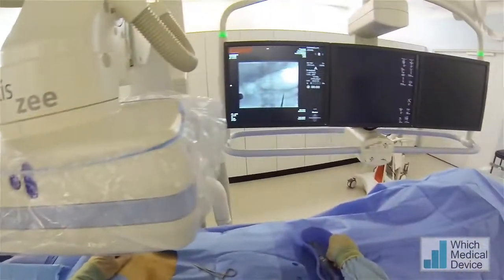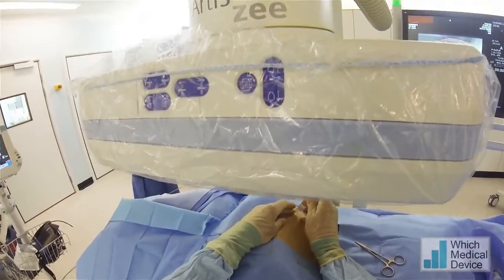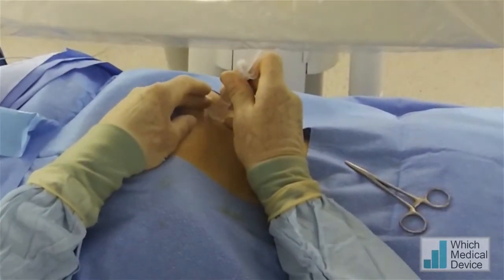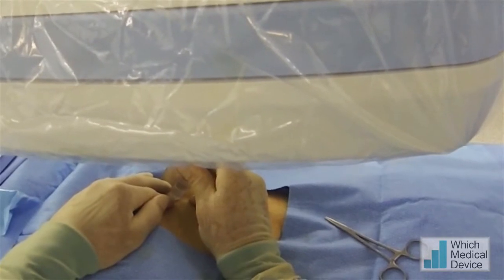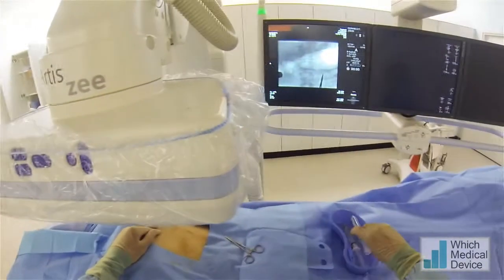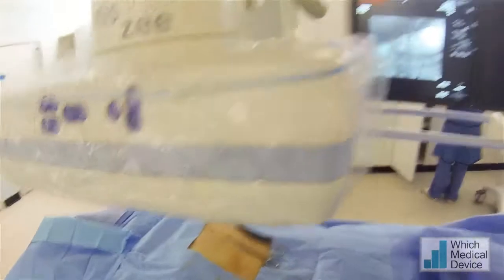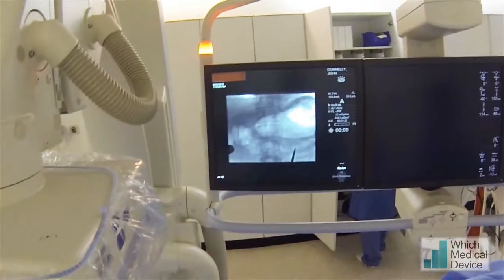I'm just going to mark my position on the skin to put the Gastropexy device in three places. And that's the lowermost one there. You can see we'll have to angle a lot to get up to the stomach from that one.